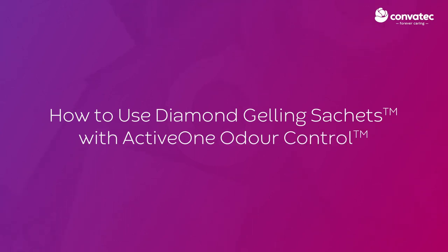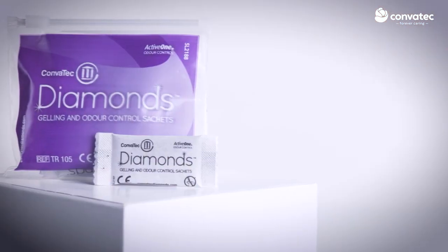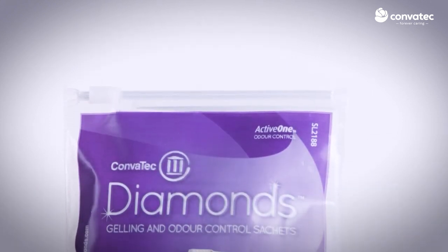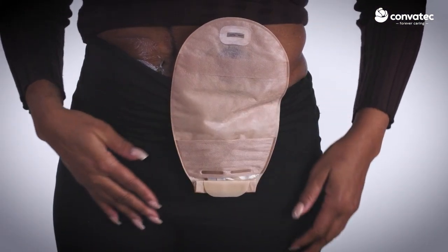Diamond's Gelling Sachets with ActiveOne Odour Control are designed for people who have liquid stool output. They are not for use with a urostomy. Diamond's Gelling Sachets solidify liquid contents and may reduce excess gas for a flatter, more discreet pouch.